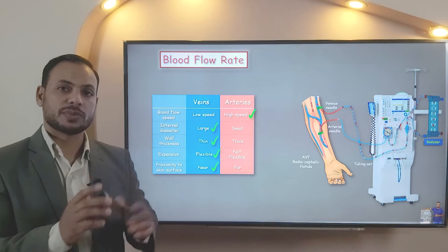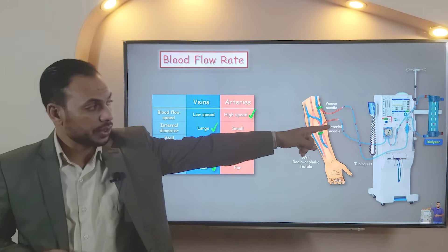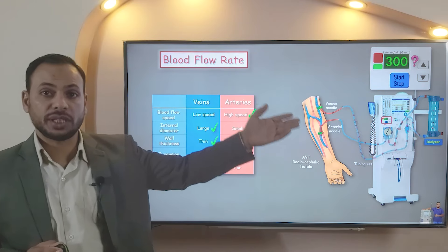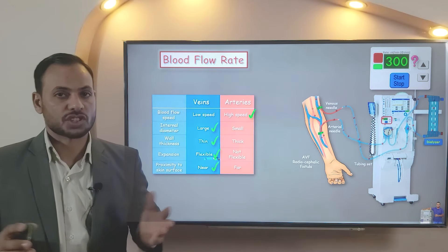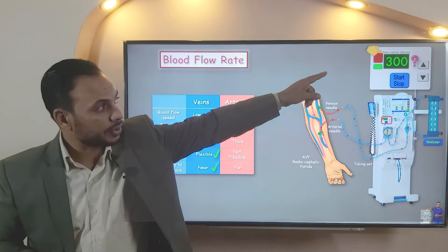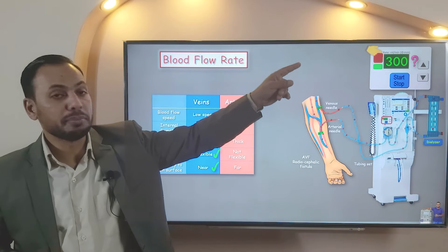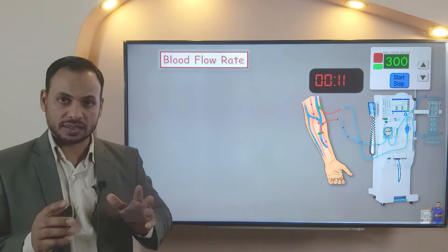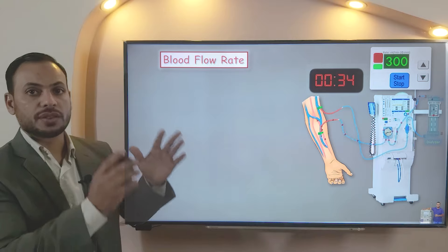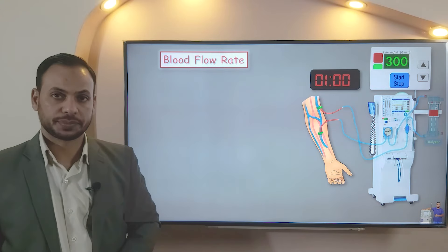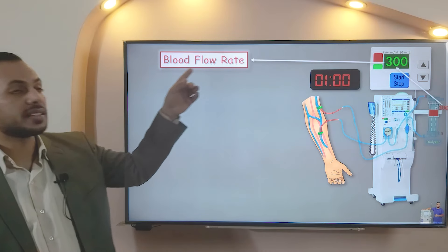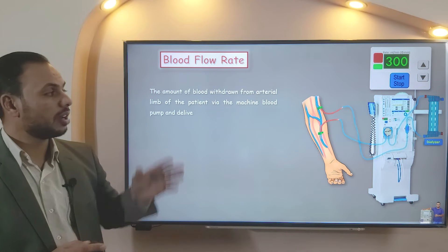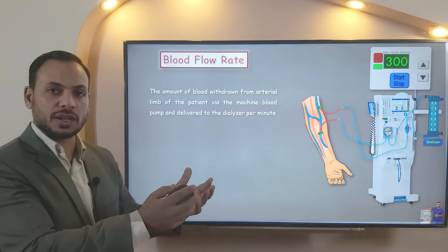This process lasts for four hours per session on average. Now, look at the number here — 300 or whatever — what does it mean? Most operators think that it is the speed of the blood pump, but in fact it's not. Look at the phrase above the number: 'rate,' and the measuring unit: milliliter per minute. It means that when the blood pump runs for one minute, it will deliver 300 milliliters of blood to the hemofilter. So, this number represents the blood flow rate — the amount of blood withdrawn from the arterial limb of the patient via the machine blood pump and delivered to the dialyzer per minute.